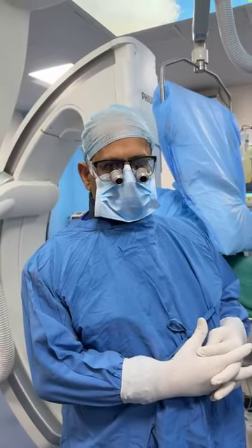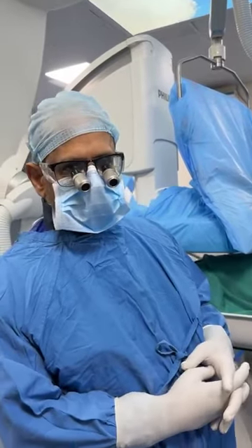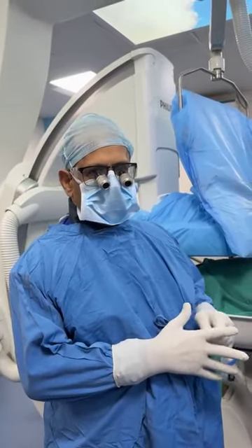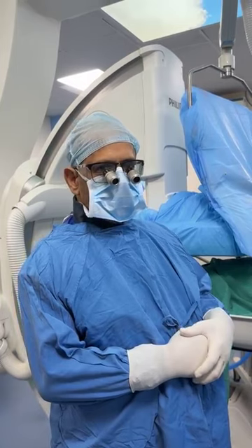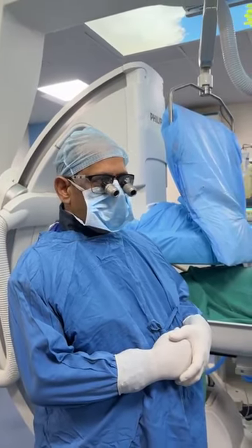This requires emergency operation in the form of a hybrid procedure, because this dissection has started from the left subclavian artery. So we have surgically done a bypass from the left carotid to the left subclavian. Excellent. And now we are going to put an endovascular stent.